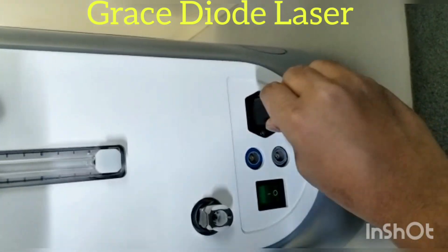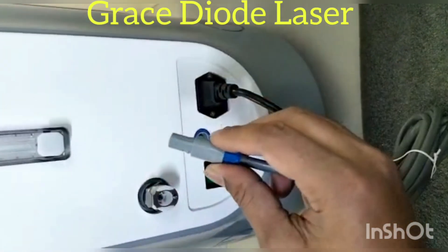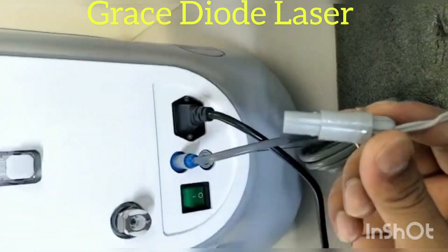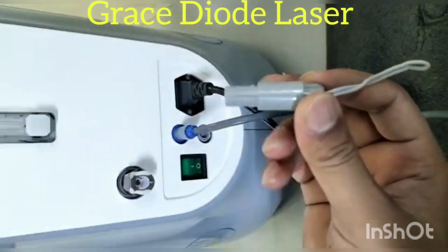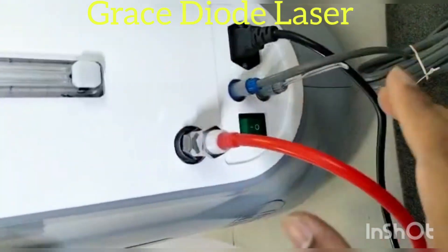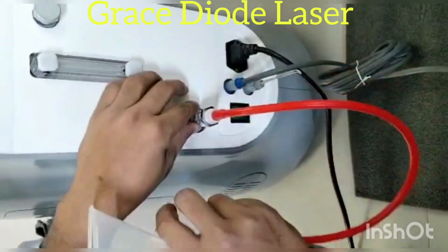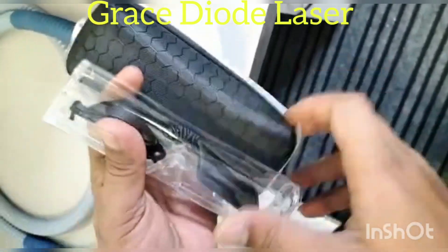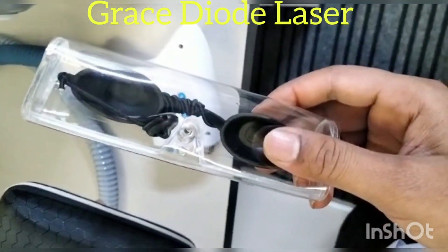This is a power socket, this is a foot paddle wire, this is an emergency key, this is an interlock key, this is a funnel used to fill the water, this is a doctor goggles and this is a safety eyewear.